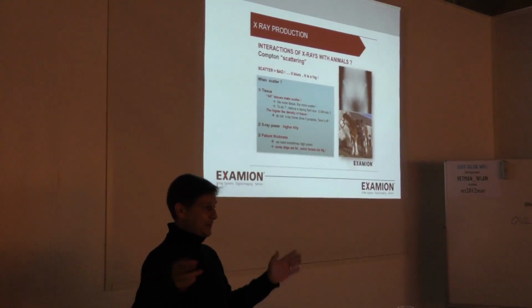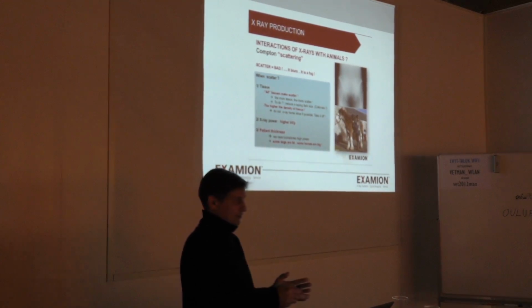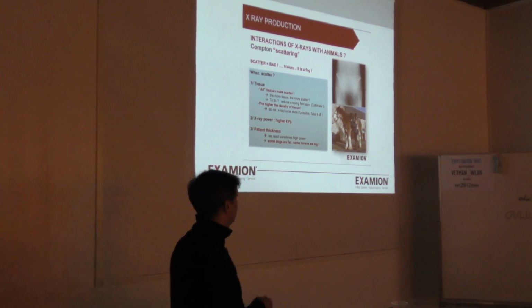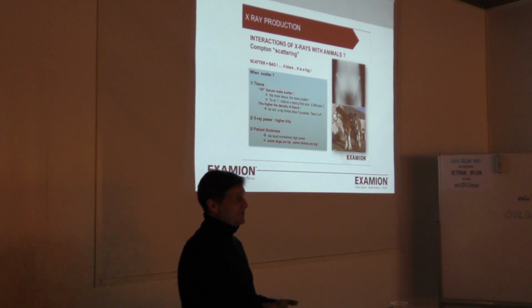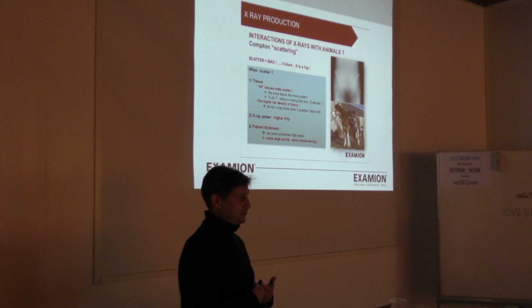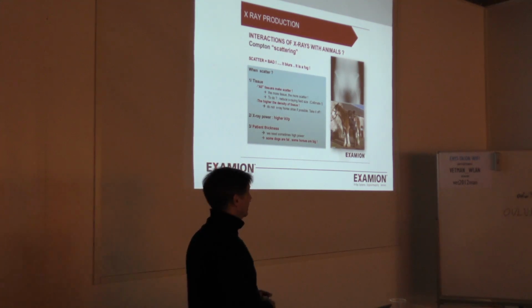So if I can use the collimator down, and I'm only X-raying smaller areas, I have less tissue, so that already reduces the scatter, because the scatter goes in all directions. So collimate. Also, the density of the structure. It's not only the thickness, also how dense it is. If I X-ray a thorax, a big thorax could be quite thick, but you will see that the scattering there is relatively minimal because it's lots of air.